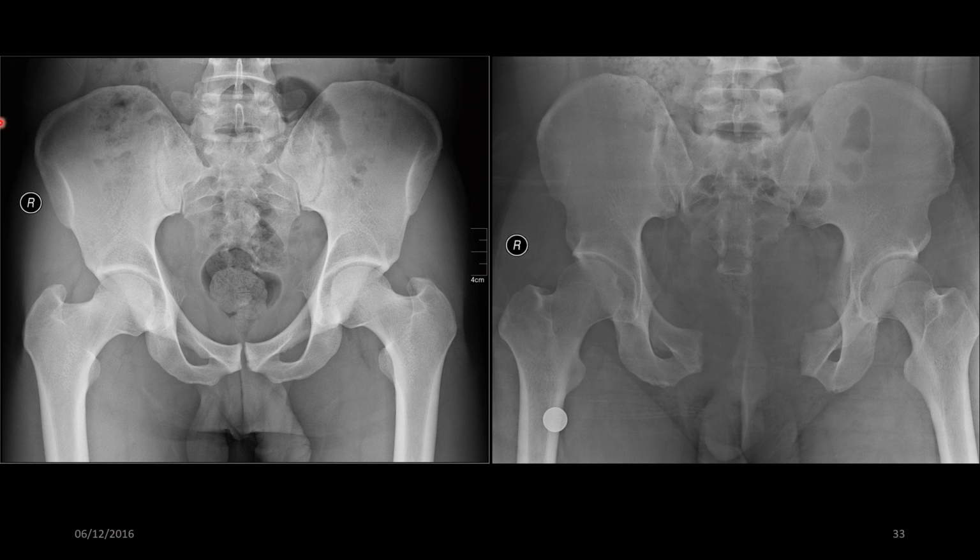Now this is a normal pelvis x-ray, and you can see that everything is roughly intact. Even if you're uninitiated, to the initiated, you've got what are called the iliac crests. These are your sacroiliac joints, and these are your hips. This is the right hip and the left hip, and the symphysis pubis here, which is the fusion of the whole pelvis. It's kind of a ring structure. Imagine it like a polo.